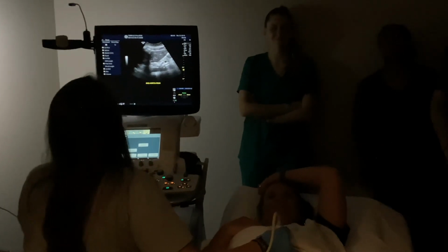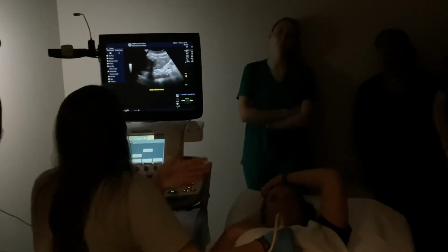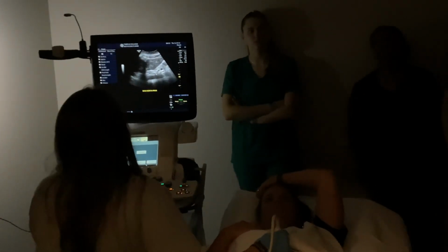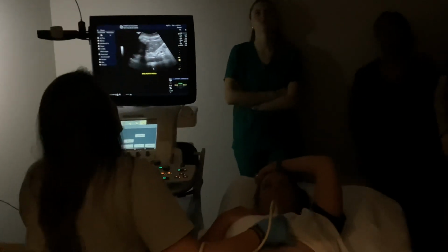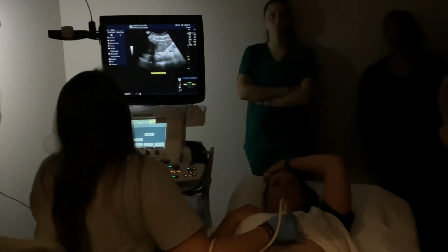So these structures that are going to come off here tell you that that's the mid. We'll get to that whenever we get to the midsection. So everything from what? Very good. So from here up is prox. So we're representing that segment. So I need that to be the focus of your image. See how it's right in the center of my screen?